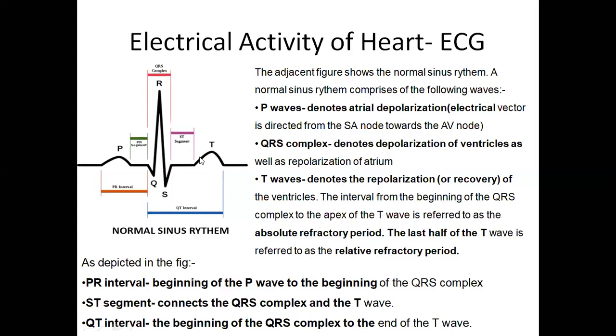You can see the absolute refractory period. The last half of the T wave, that means from here to here, is referred to as the relative refractory period.